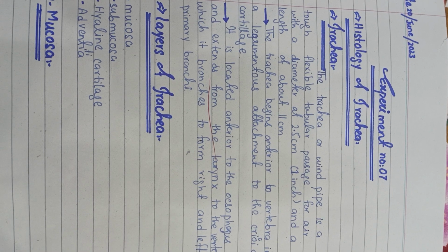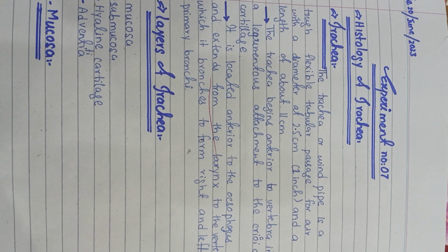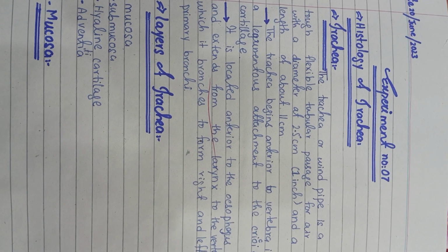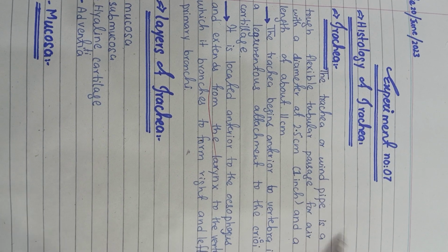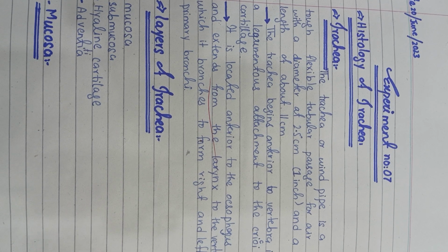Assalamualaikum everyone. In today's lecture, we are going to discuss experiment number 7 of anatomy, and this practical is about the histology of the trachea. So now we are going to discuss what the trachea is and what the layers of the trachea are.